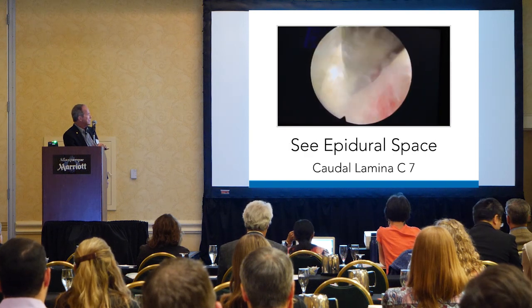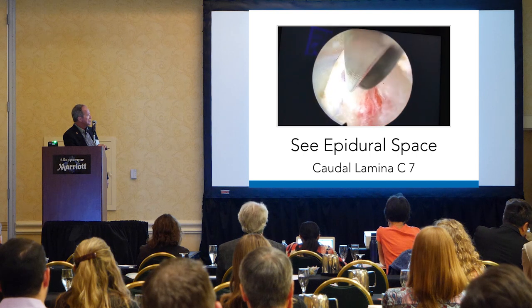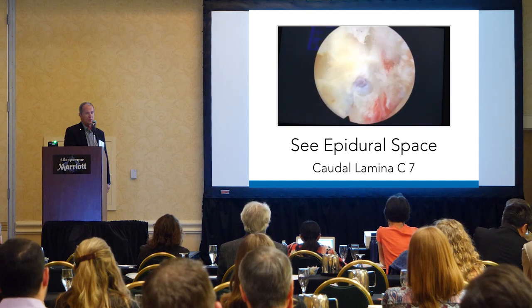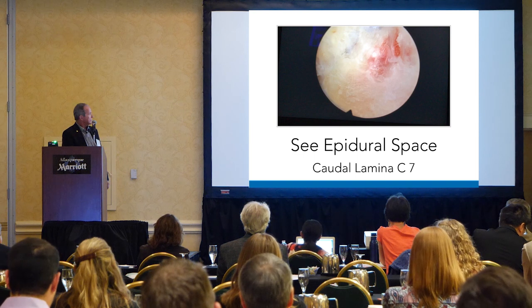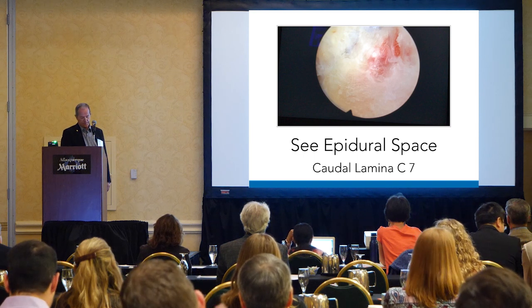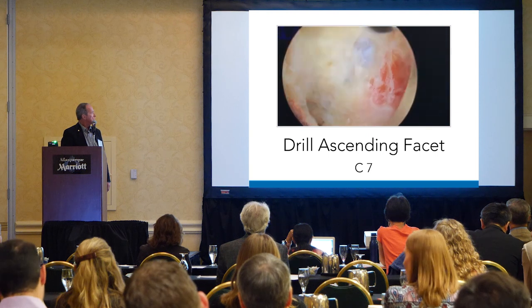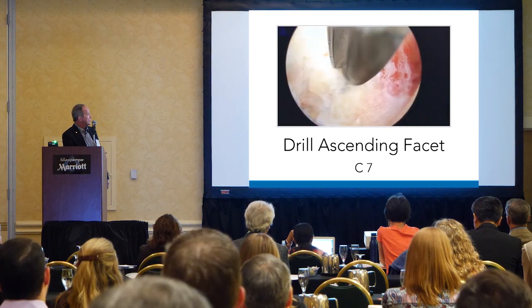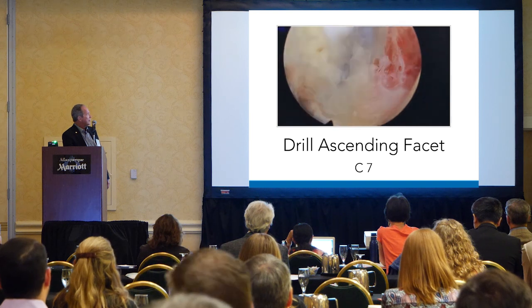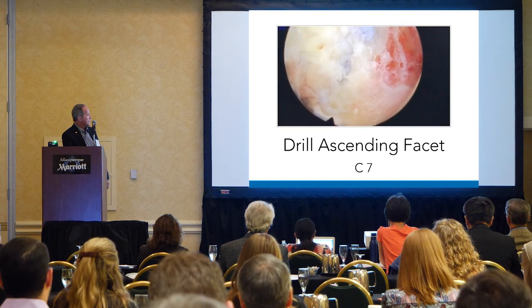And sometimes there is the epidural space, so it's not unusual, when you're drilling through the bone, that you get through and you'll see the epidural space poking its head in your direction, which is okay. There's that little hole we saw for the epidural space. We're going to continue to come lateral, and we're going to be thinning out the caudal lamina of 7.